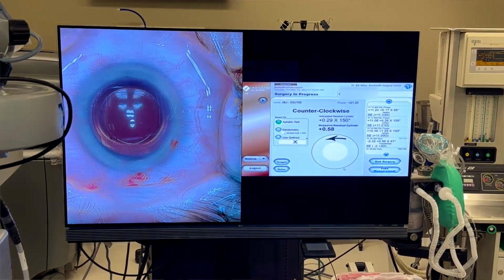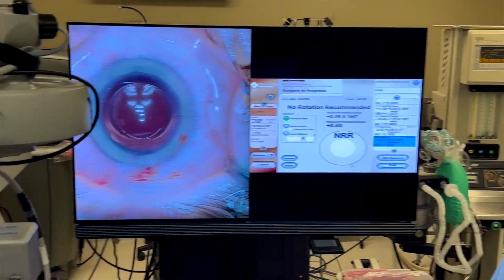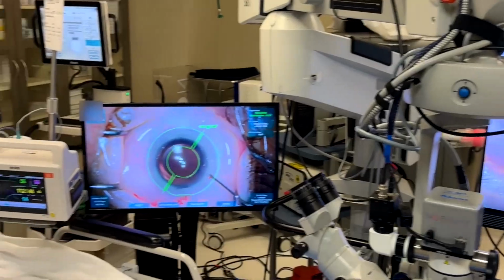Traditionally, I've used a lot of intraoperative aberrometry to help, number one, make the diagnosis of astigmatism, power, and axis, and then use that to guide me for that toric lens placement. I've seen firsthand direct head-to-head comparison looking at intraoperative aberrometry as compared to intraoperative guidance from Cassini, taking preoperative images and relaying that intraoperatively based on total corneal power. And I was reassured to see, number one, that both intraoperative aberrometry and preoperative total cornea were very much aligned and sort of agreed with each other to make me feel confident that if I only had to rely on preoperative information, I think that would be possible.